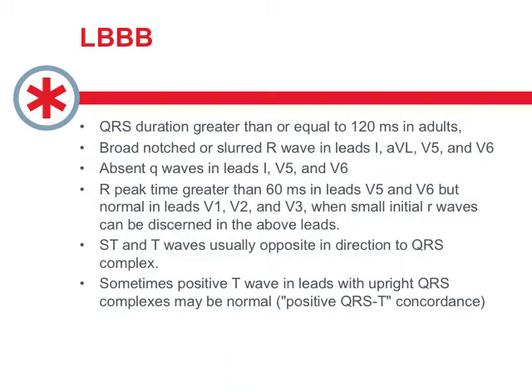So if you really want all the ECG diagnostic criteria, here they are. And they do make sense if you work that through with those electrical vectors we just talked about. But let me sort of hit on what I think is probably the more useful 3 points here.